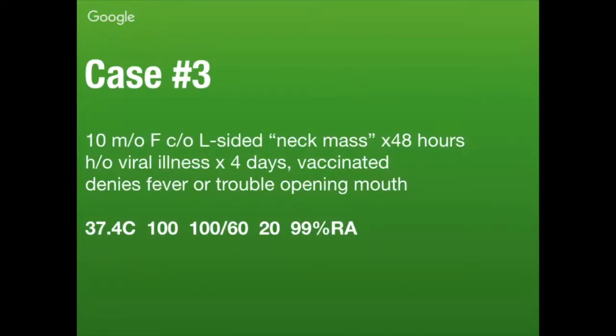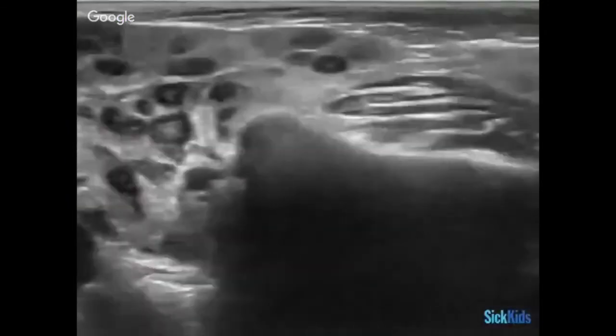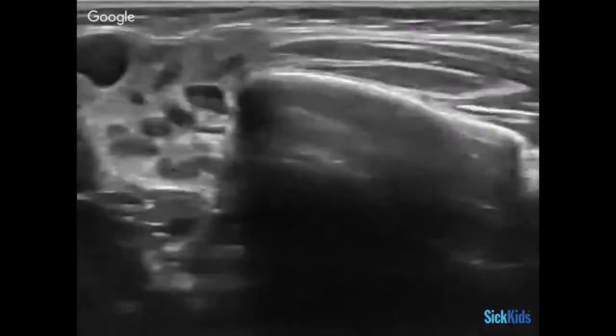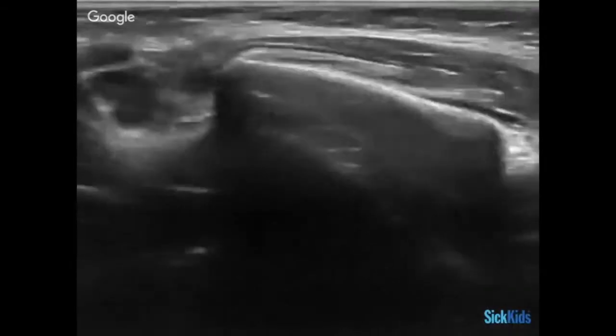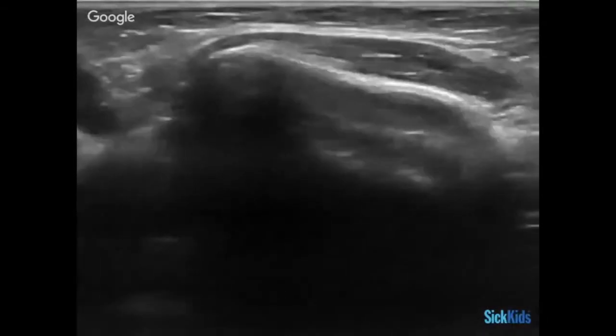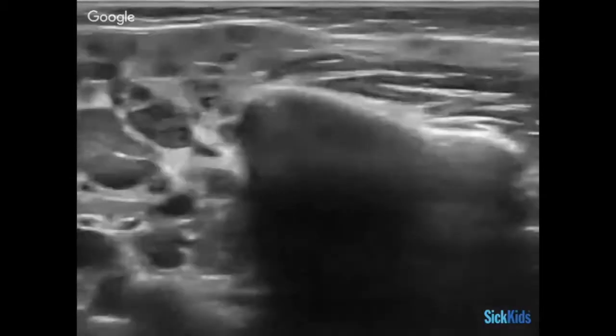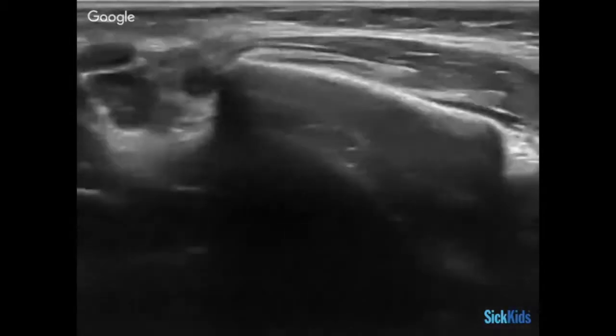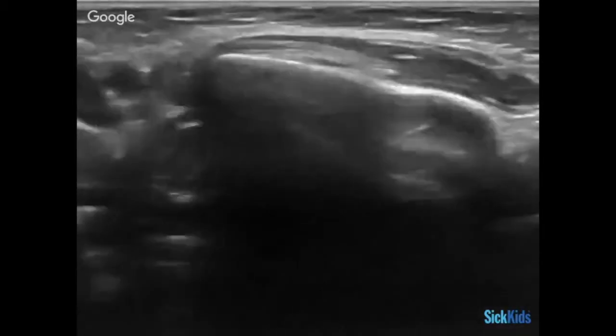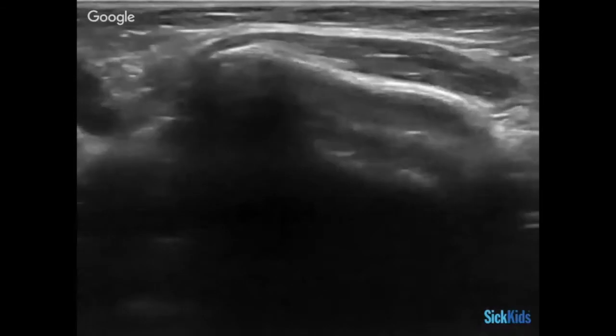So it's kind of this neck mass. But when you put the transducer on it, this is what you see. What are we seeing here? Parotitis. And how is it described classically? Has anybody really seen anything eaten by a moth? It looks like this.